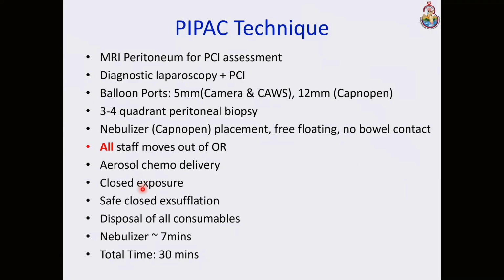So essentially it's a closed exposure, and once the procedure is over, one person enters into the OT and stops the CO2 and opens the exhaust valve. So it's a closed suction drain. There is no contamination in the OT atmosphere. And once that is done, the rest of the team enters. Other important point is that all these are disposed of as a chemo disposal system, completely separate of all the things without contamination.